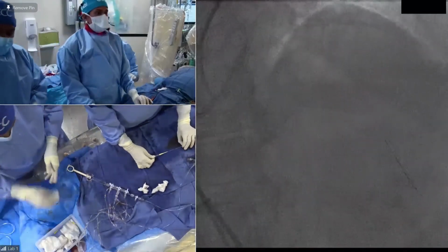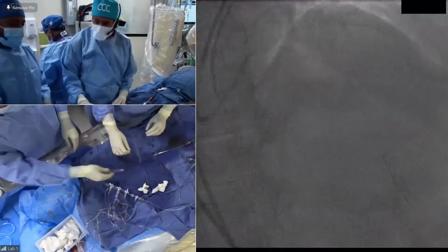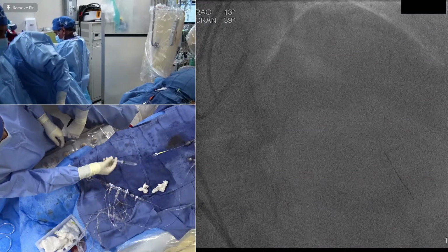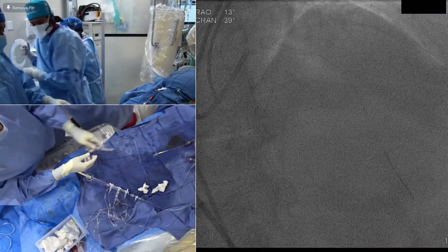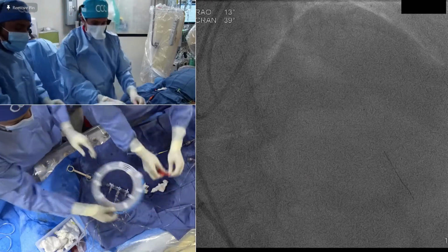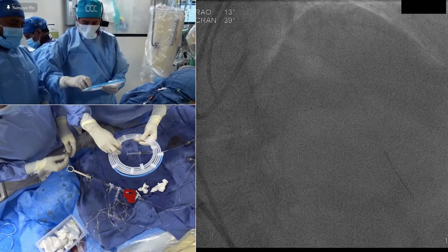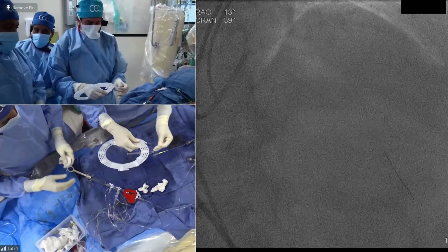George, in this case, we've tried the Rota drive wire, and I like it more than the Rota floppy. It doesn't bend as much. You could actually free wire it a little better than the floppy. So I think it's like $10 more, unfortunately. The administrators always go nuts over $10. But that's it. Here goes our coffee.